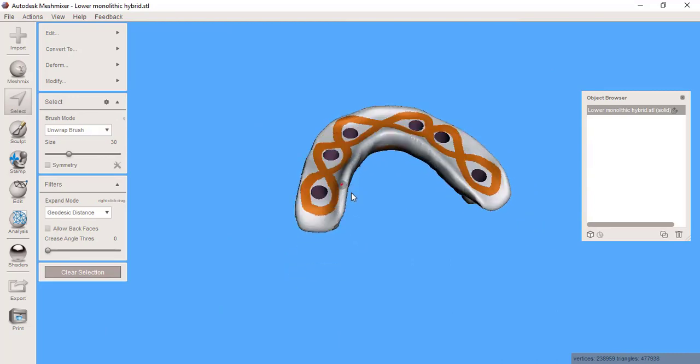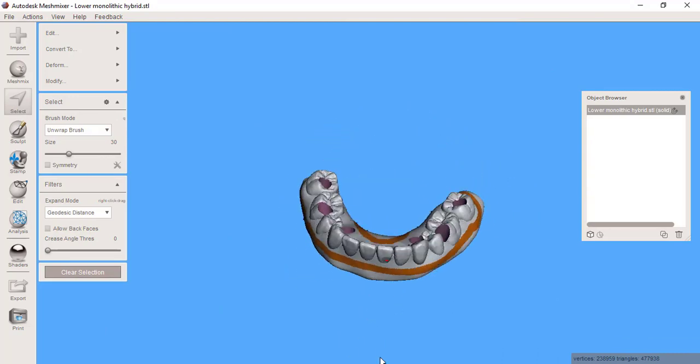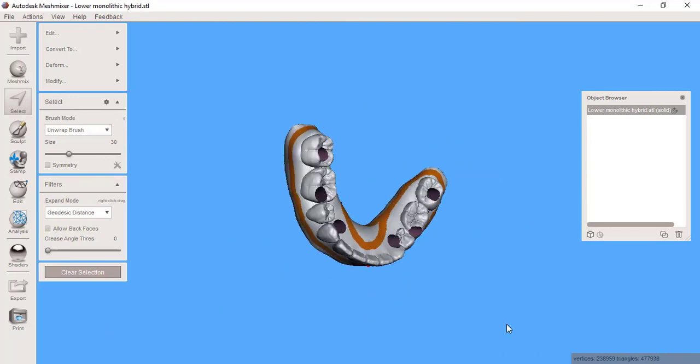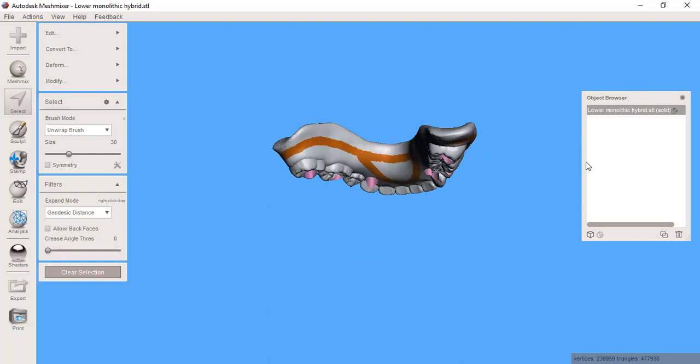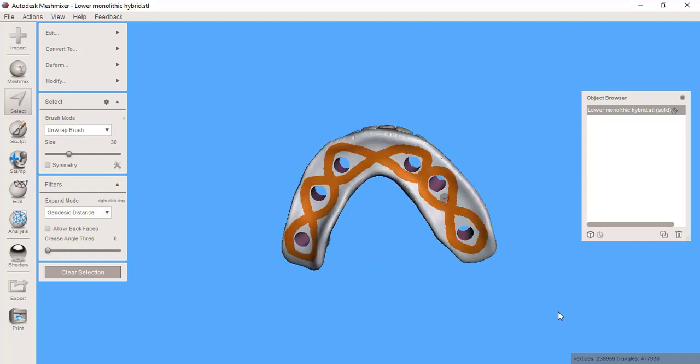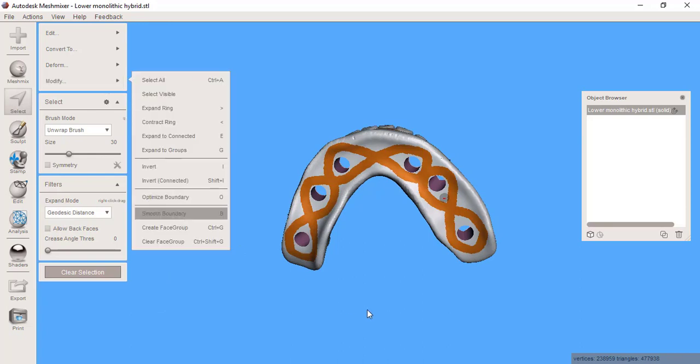Now you can see the design that I've gone with. I've got one continuous one around the outside and then the same thing on the underside. With that done, I'm going to optimize the boundary and then smooth the boundary.